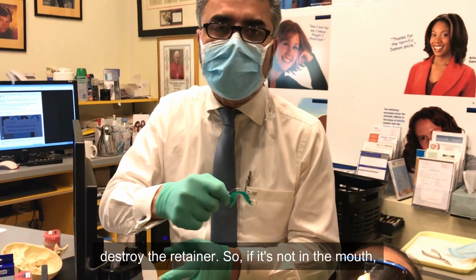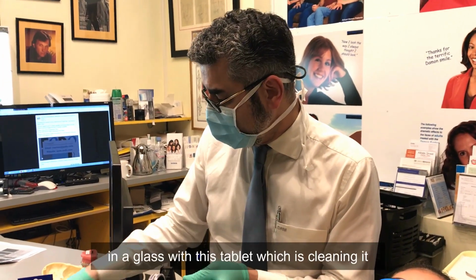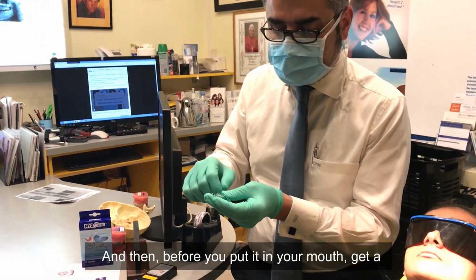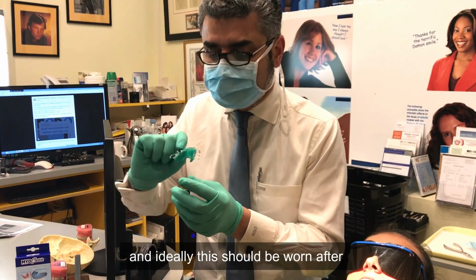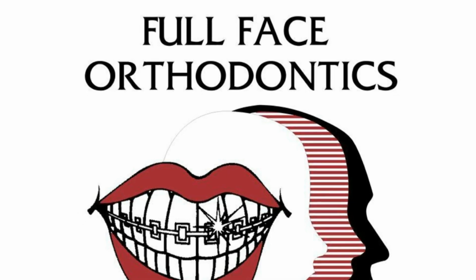So if it's not in the mouth, it should be kept well away from household pets in a glass with this tablet, which is cleaning it. And then before you put it in your mouth, get a toothbrush, give it a good clean, click it in. And ideally this should be worn after dinner and at night time.